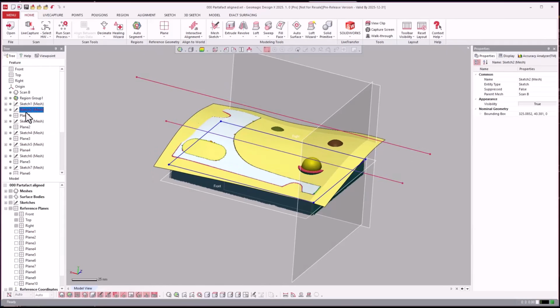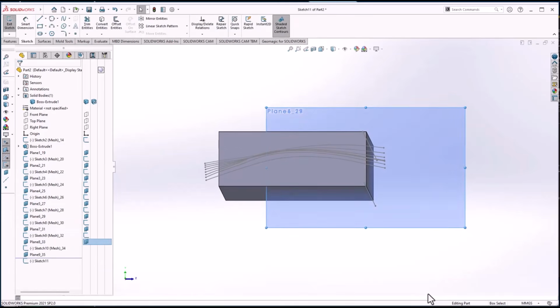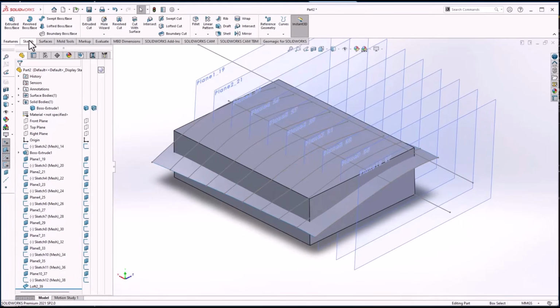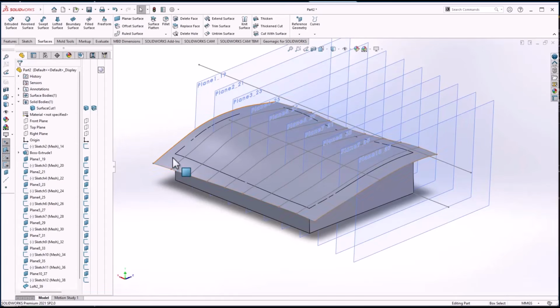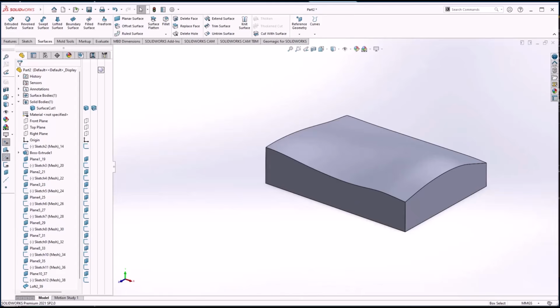And then from there, I could just click the next spot on, because I did 2 sketches. So now I can just come over here, resume from plane 1, hit send. And you'll see that it's building those 2D sketches in, and it creates a loft for me, and it says export succeeded. And then you just use your regular surface modeling stuff over here, where I say I want to cut with surface and flippy flip. Hide it. And there we go. Hide all my planes. Hide all my sketches. So there we are so far. And now I'll just toggle back over.